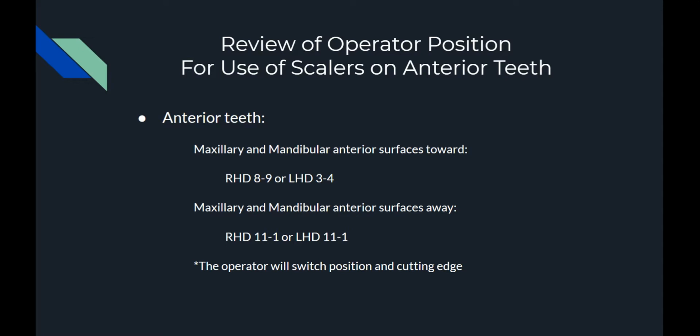Maxillary and mandibular anterior surfaces away. Right-hand dominant 11 to 1, left-hand dominant 11 to 1. Both the right-hand dominant and left-hand dominant operators would sit at 11 to 1. Most operators choose 12.